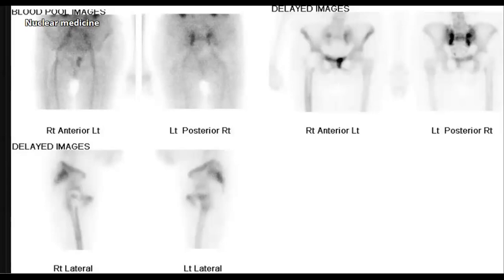And again, you will be asked to say that I will correlate with X-ray or maybe CT or MRI, which is more specific in the MRI. So in that case, everyone will be happy with your answer. Let's go to another case, another type.